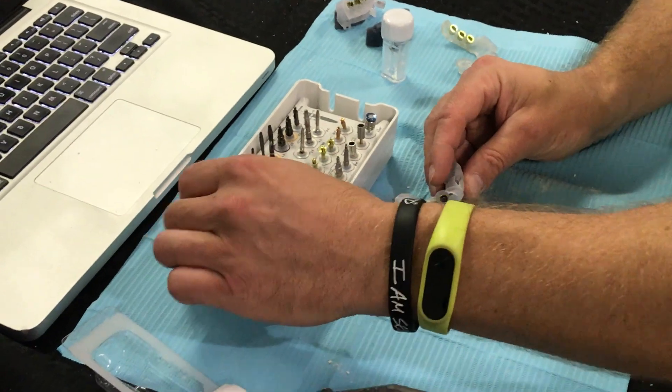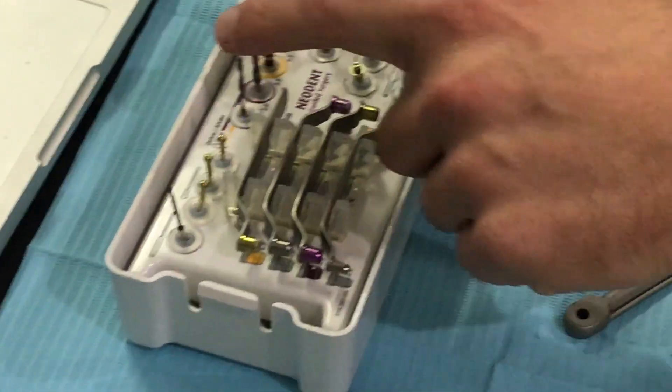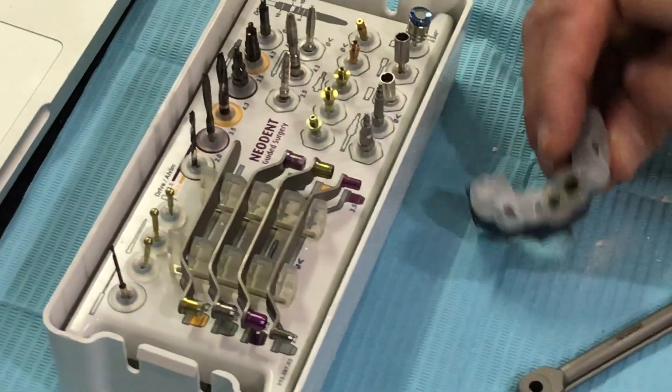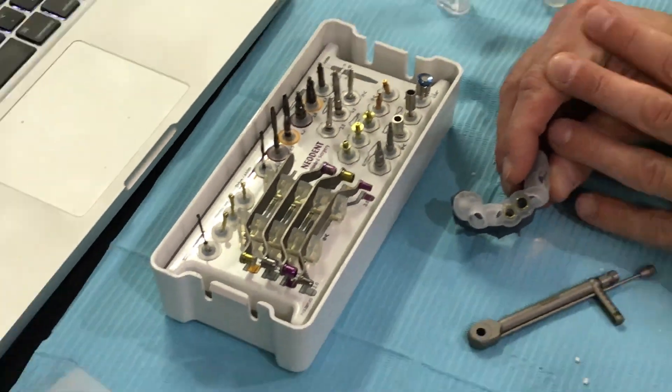You have your fixation drill for the facial aspect if we lock into our guide. You have your two millimeter twist, three five, four three, and then we have countersinks. Everything in this top row would be used at a high speed at 800 RPMs.